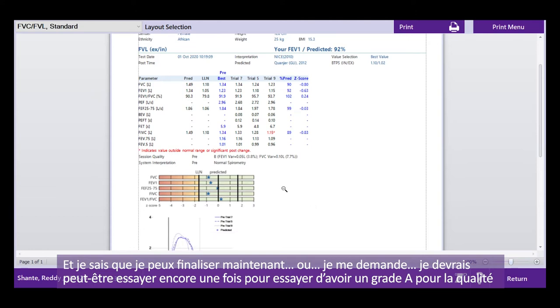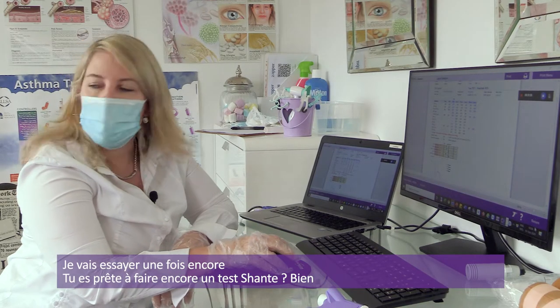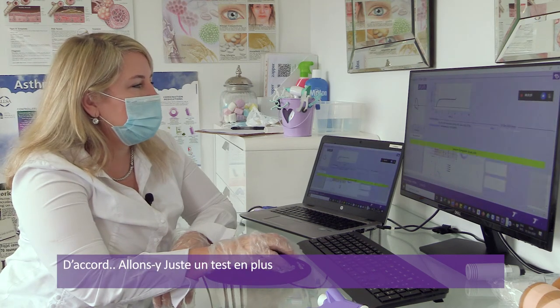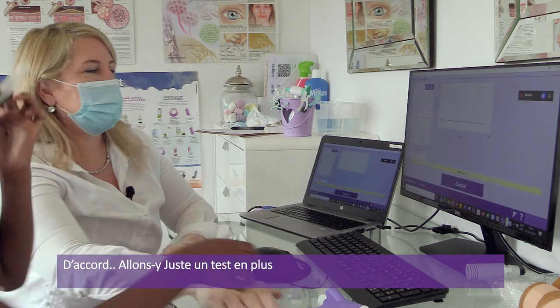Well, I'm just wondering, maybe I should try one more to see if we can get it to a quality grade A. Let me try one more blow. Are you prepared to do one more blow, Shanti? Good. Okay, let's give it a bash. Let's try one more test.